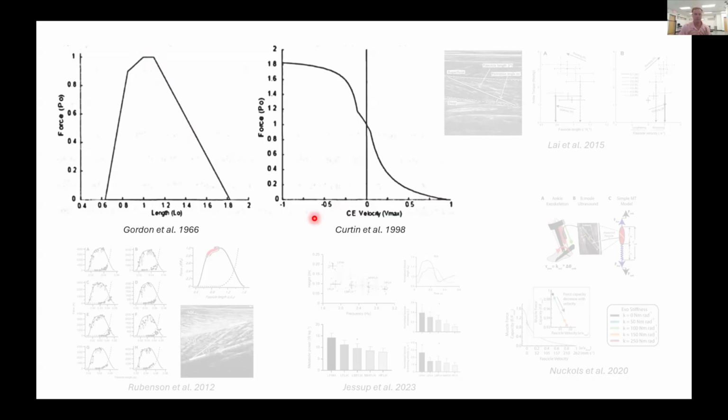But again, if we know the relative length and velocity of a muscle, we can approximate how the operating capacity of that muscle changes, which has implications for understanding how and why people move the way that they do, and potentially how we might facilitate movement, targeting those length and velocity changes.